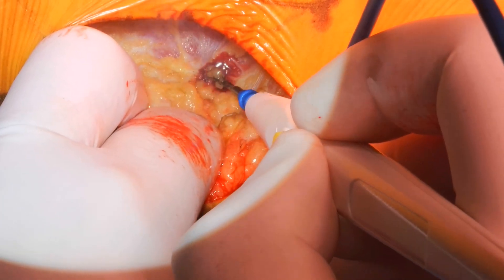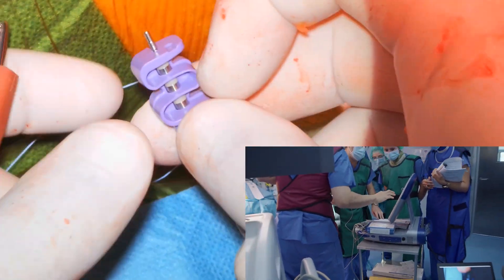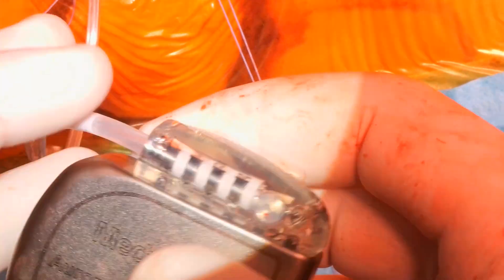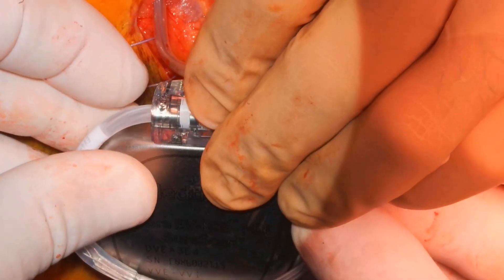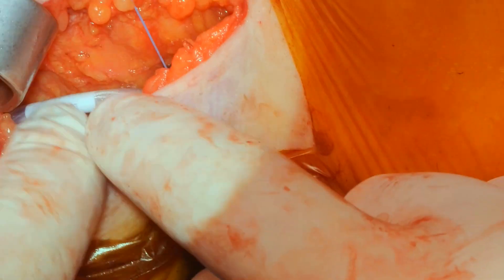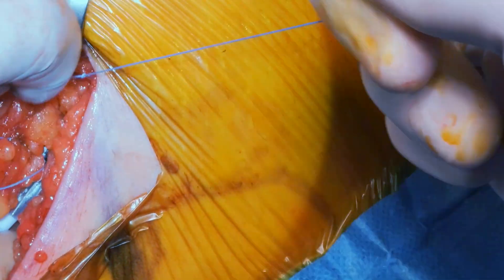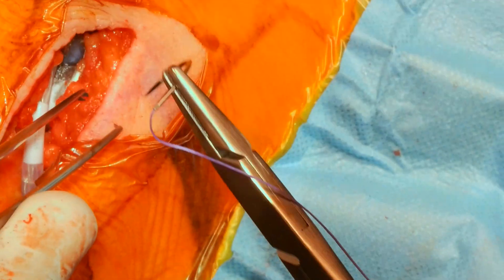A transverse tunneling tool is used to deliver the proximal portion of the lead to the device pocket. After retrieving it, we perform a second confirmation of sensing, stimulation, and therapy function before connecting it to the generator and carefully placing it in the pocket. It is crucial to position the generator properly to avoid external compression or tightness with the subcutaneous tissue. This helps minimize discomfort during chest or upper limb movement and reduces the risk of pressure ulcers during the postoperative period. Once everything is in order and the extravascular ICD is functioning well, we close the surgical wound.